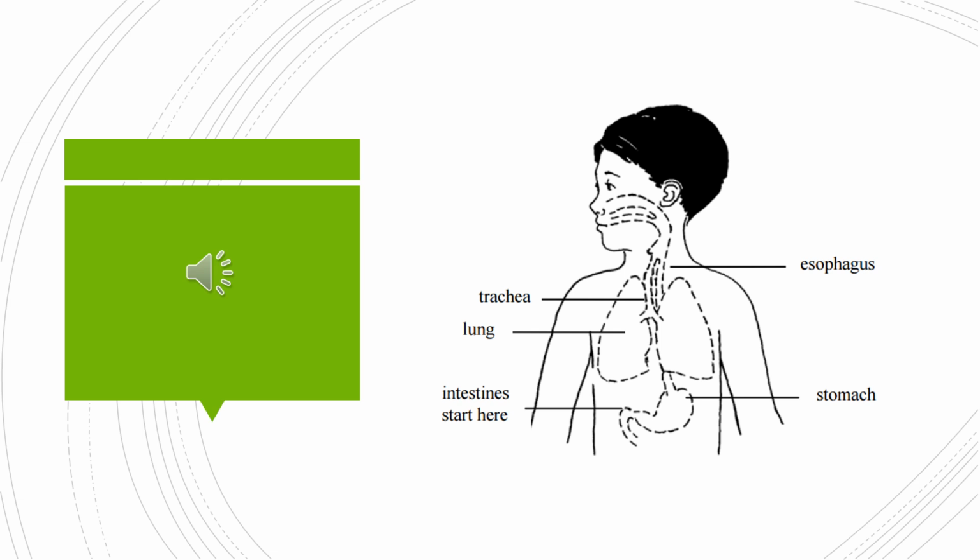There are many different types of feeding tubes, and the type of feeding tube that a patient receives is based on their immediate needs. A nasogastric feeding tube, also called an NG tube, is passed through the nostrils, down the esophagus, and into the stomach. This type of feeding tube is generally used for short-term feeding, usually less than a month, though some infants and children may use an NG tube long-term.